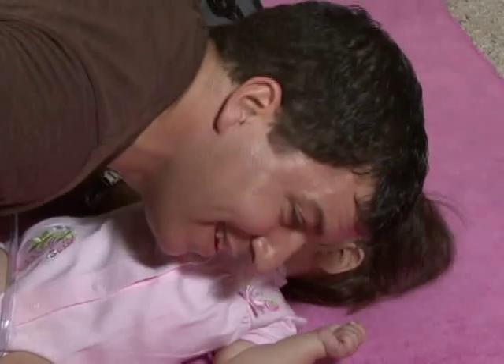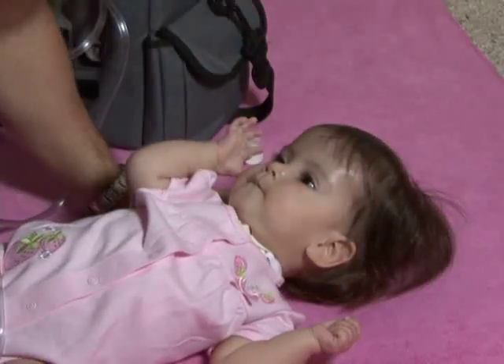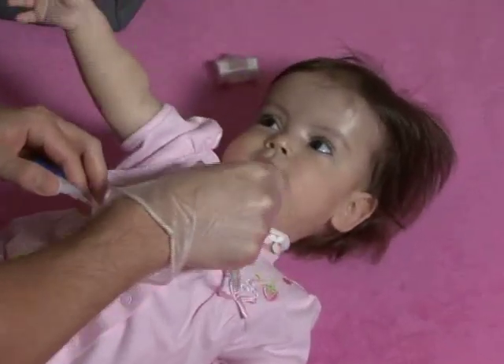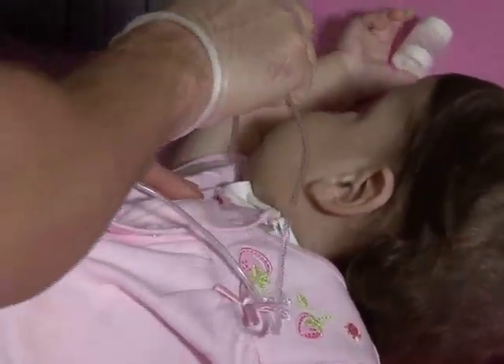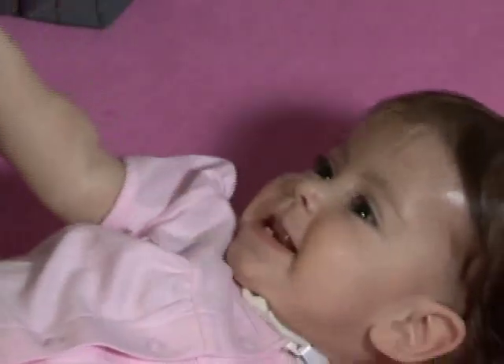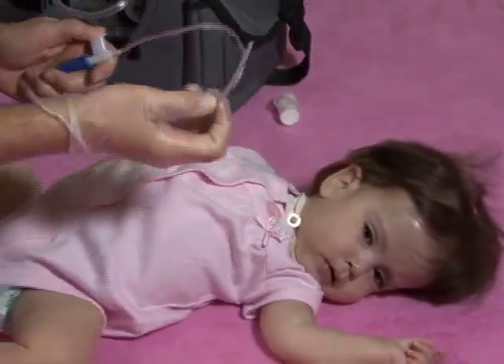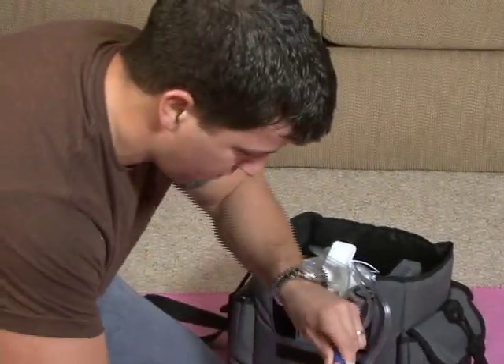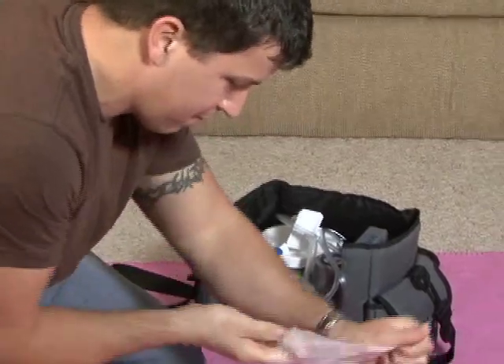Now stop and listen carefully. Do you still hear coarseness — or as we like to call it, gurglies? If yes, go ahead and pass the suction catheter down again. Usually two times is sufficient, but if the child is sick or is having an extra gurgly day, you may have to go down a third time. The goal is to allow the child to breathe freely and clearly. When suctioning, you should always take a quick glance at the mucus you are suctioning out. You will get to know your child's mucus and will be most able to judge when something has changed. Don't be afraid to remind the doctors of this — you know when something is wrong, and as your child's advocate, it is okay to insist.